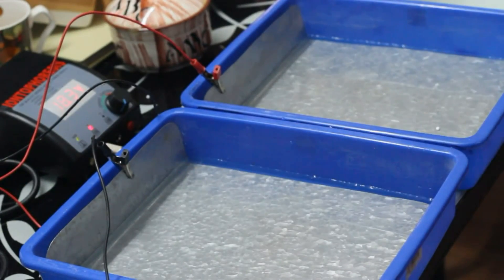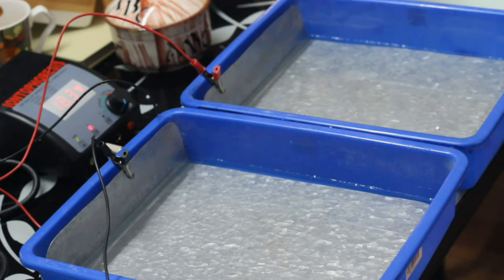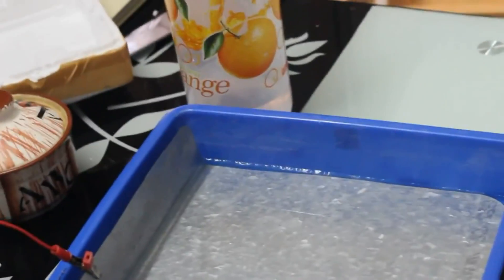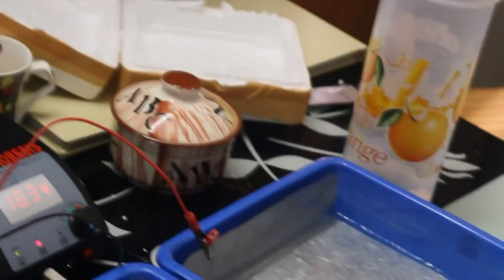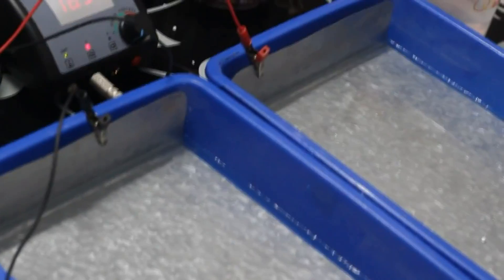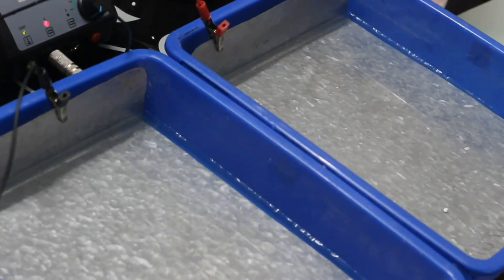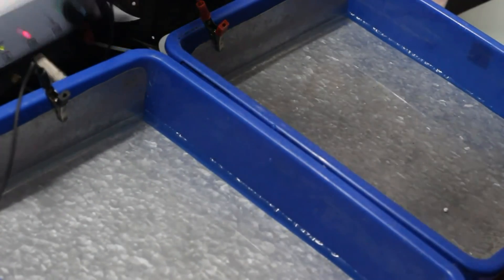Now, I'm connecting the alligator clips. It is nothing like the right should be on the right side or left clip should be on the left side. You can put the clips randomly. I'm going to adjust the camera a little bit so that you can see clearly how I do the procedure.